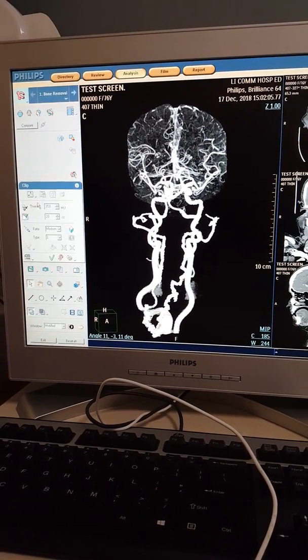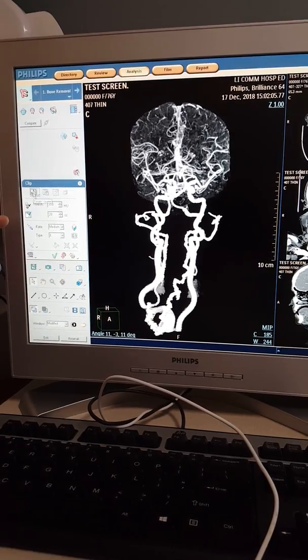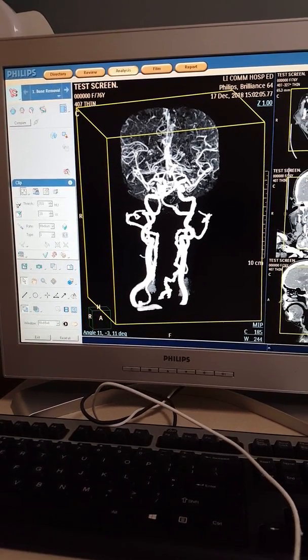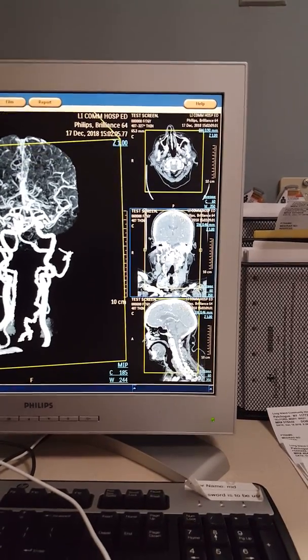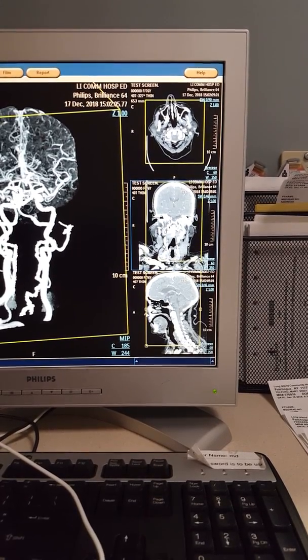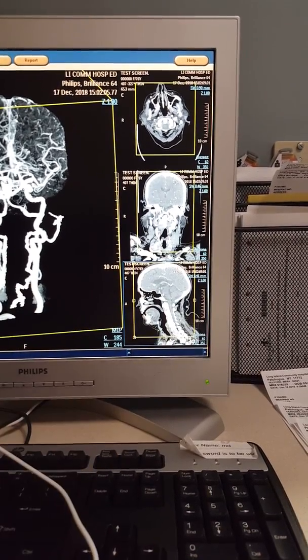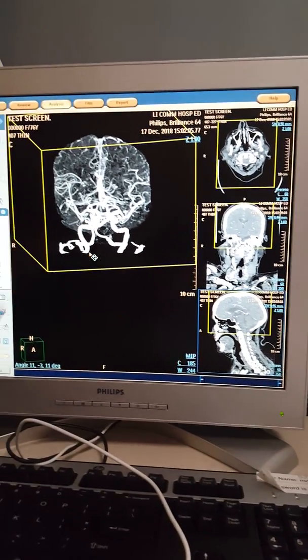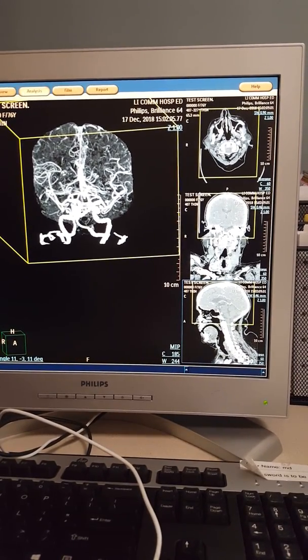You can clip first or now, it doesn't matter. Click clip and we're going to work left to right. The only two boxes we're concerned with are the target volume box and the hide-and-show box. The yellow bucket lets you insert the brain — work through those two. Raise the target volume box up to include the head, adjust the sides as needed. Then we want to eliminate the carotids — I like to do it from the sagittal view, bringing it right up to the bottom. You'll see a little bit of carotids — that's okay.